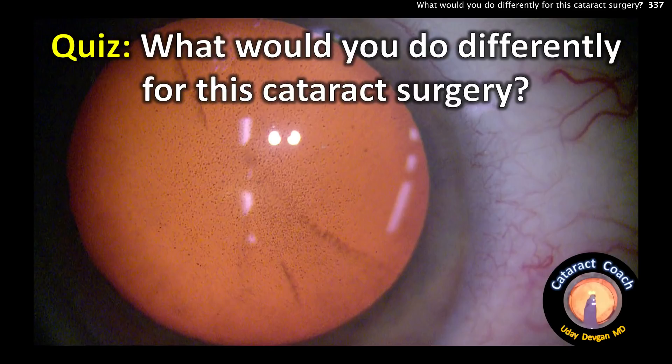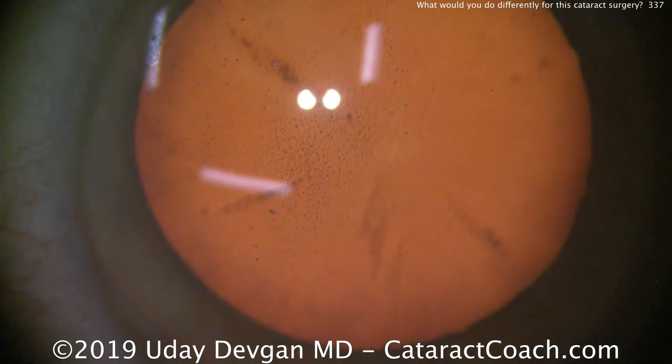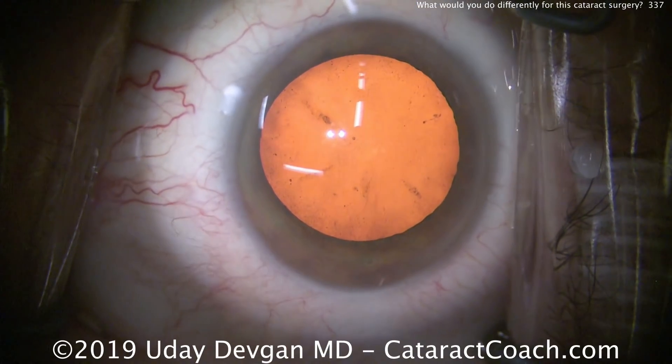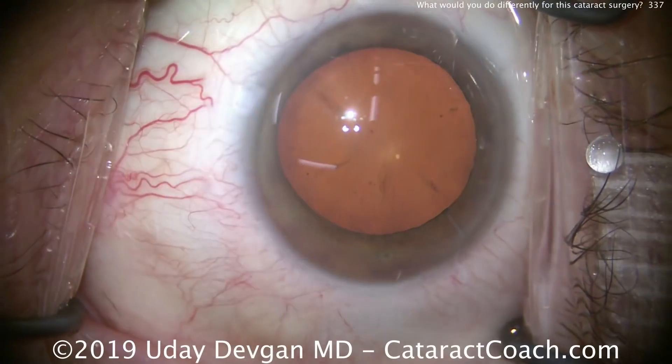Cataractcoach.com — Quiz. What would you do differently for this cataract surgery? Look carefully. What do you see there? That's endothelial cell dropout. That's looking at the corneal endothelium, and of course, this patient has Fuchs' corneal dystrophy.